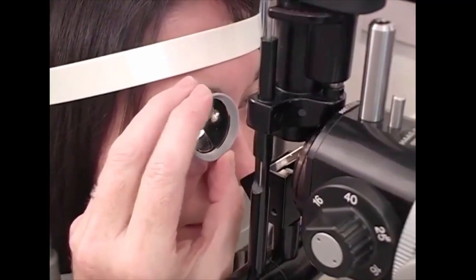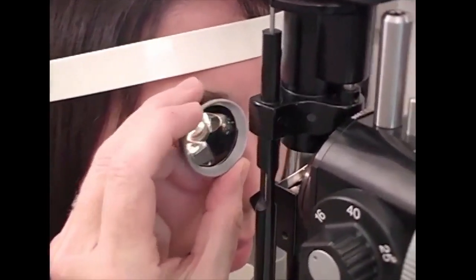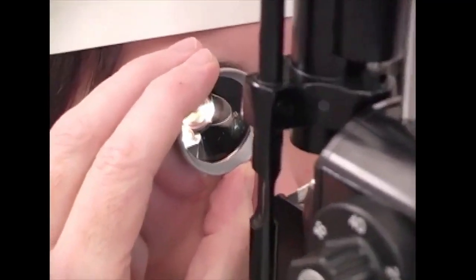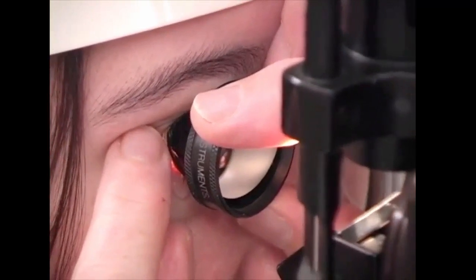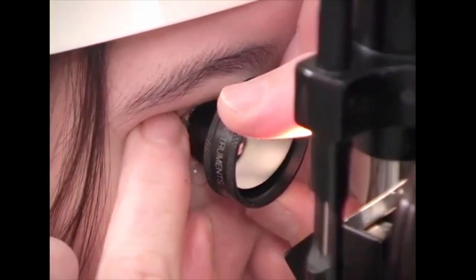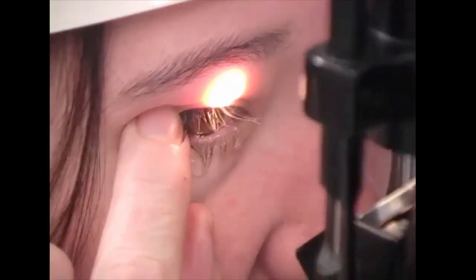So here I am using 3 fingers to rotate this lens. When I'm done, I just push against the globe with my other finger so it breaks the seal. Sometimes these get stuck on pretty securely.